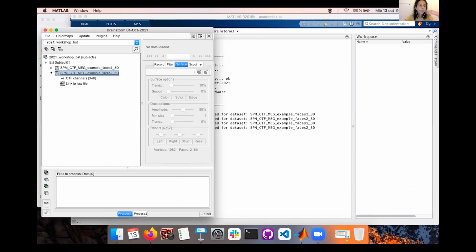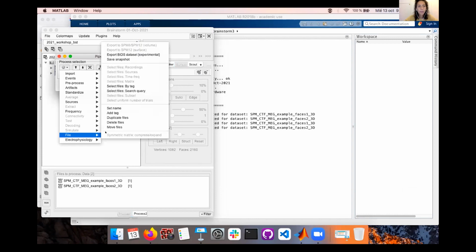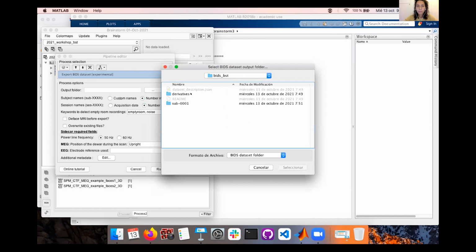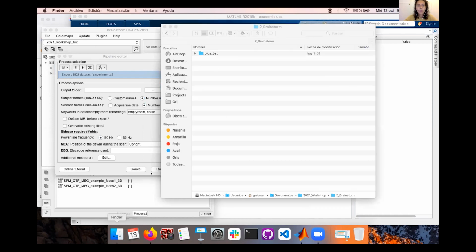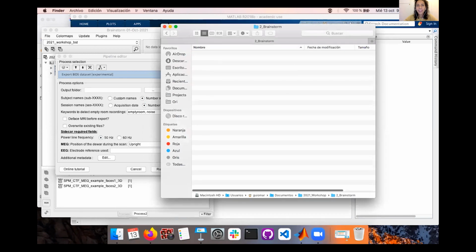So then you will have here your files. This could be any protocol you have already created before. So if you just drag and drop your files here and click run, you will see how you can, in the file tab, say export dataset. It's experimental for now, but I think it does a good job for a first approach. So you have to specify your, I have the old one, so I'm going to delete it because I was testing it before.